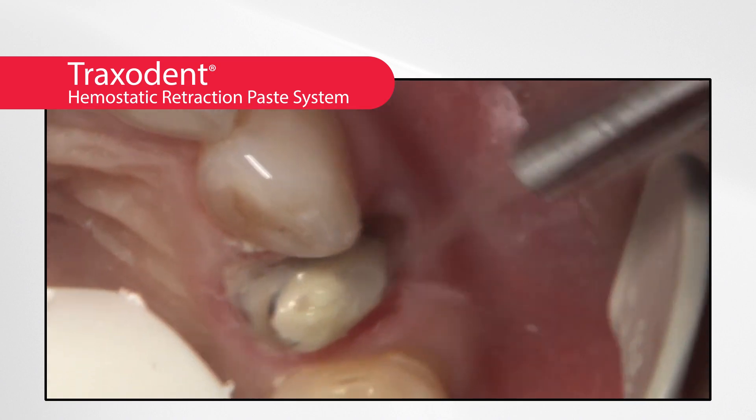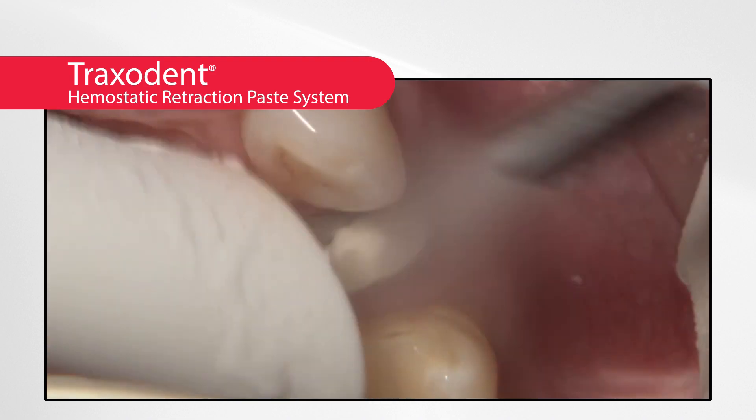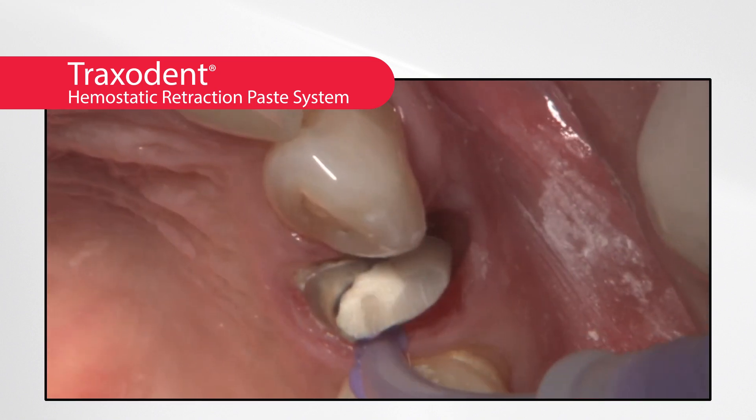After two minutes, the paste is removed by thoroughly rinsing the area with water. After gentle drying, the tissue should appear free of moisture and blood and ideally prepared for the final crown and bridge impression.